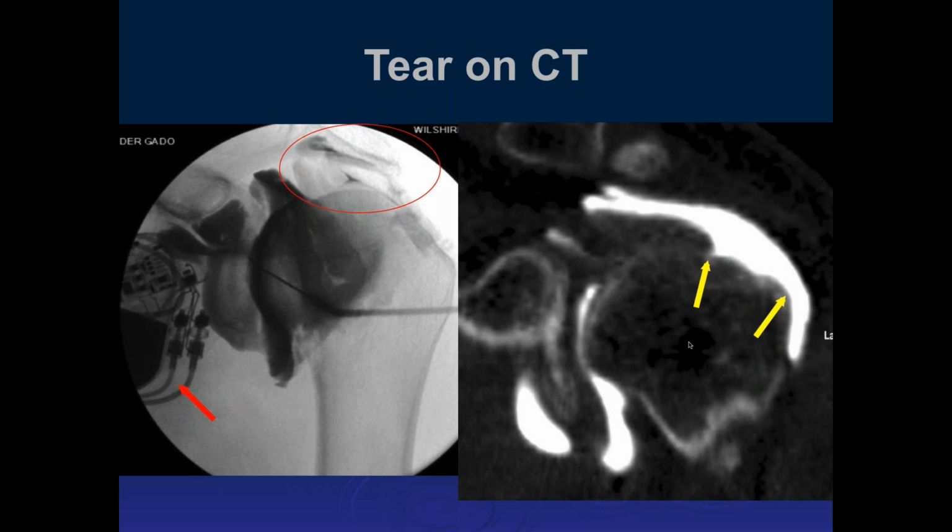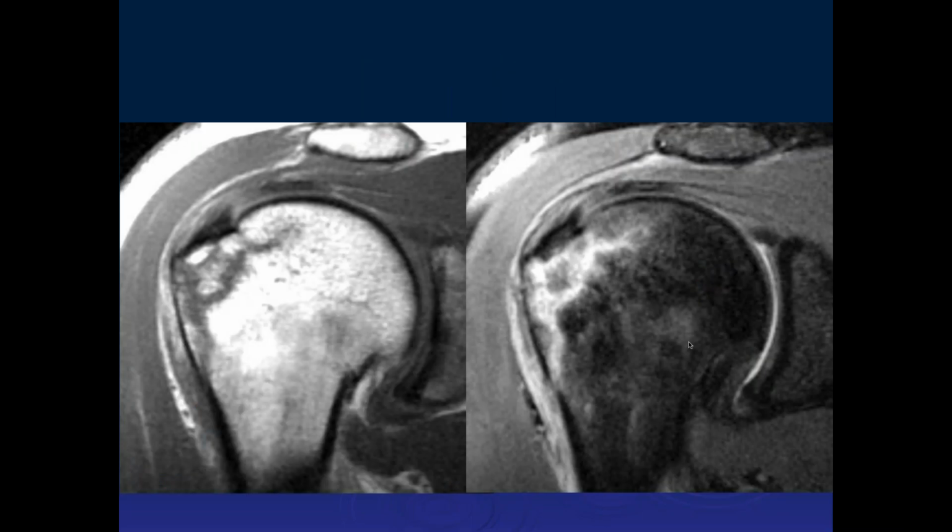And now a lot of them have been studied. Recent studies have shown that they're basically all safe. And for ultimate caution, though, it's recommended that you only do people if you know that they have a modern pacemaker, and you have someone available at the scanner who can treat arrhythmias and provide advanced life support in case it's necessary. It generally means that those patients need to be scanned in a hospital out of caution.